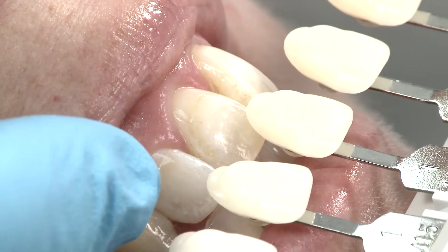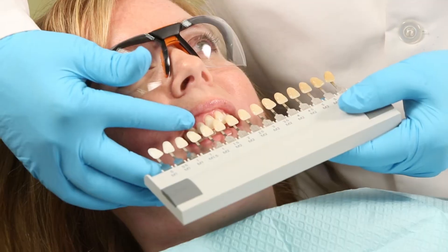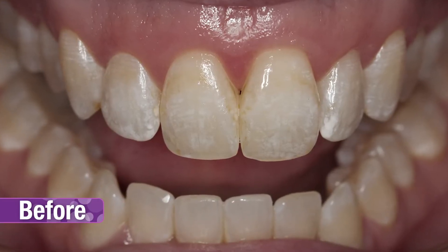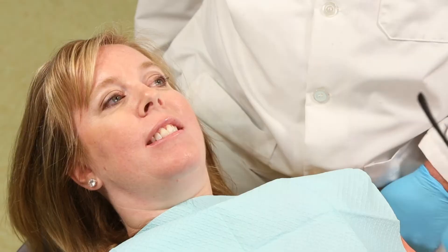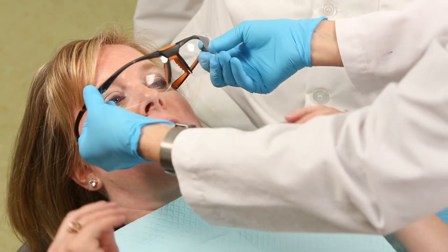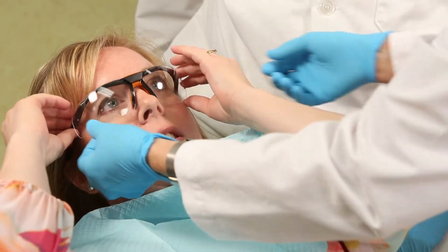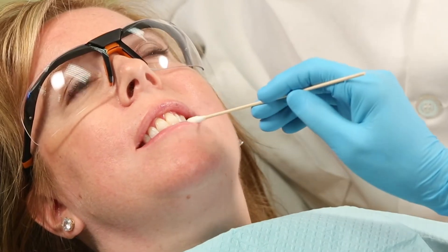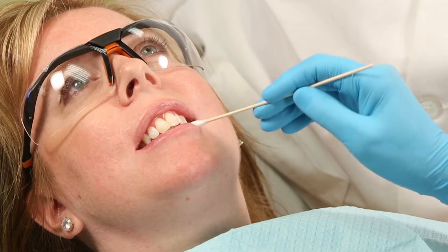Before beginning the procedure, determine and record a baseline shade. It is also recommended to take photographs for patient records. Because of the hydrochloric acid contained in Opal Luster, isolation is extremely important. Also, both you and your patient should wear protective eyewear. For additional patient comfort, apply a lip emollient prior to treatment.